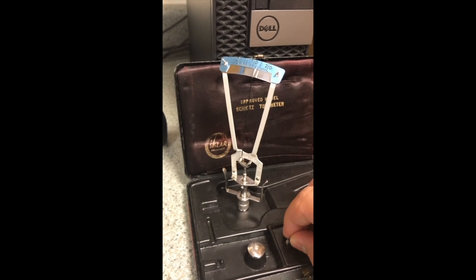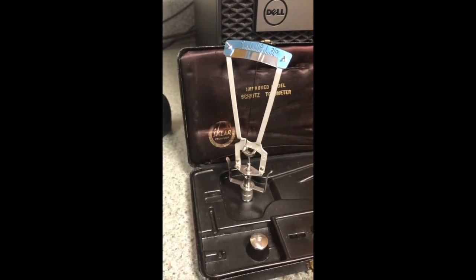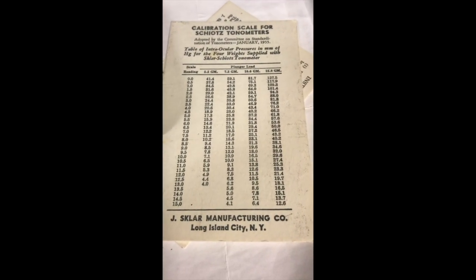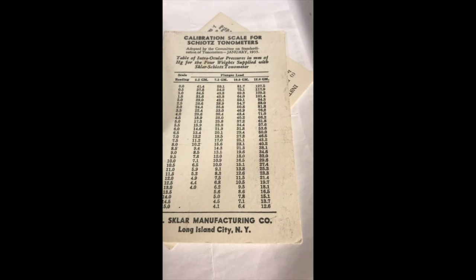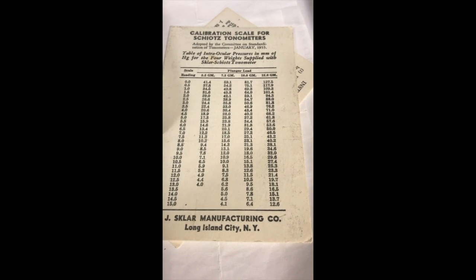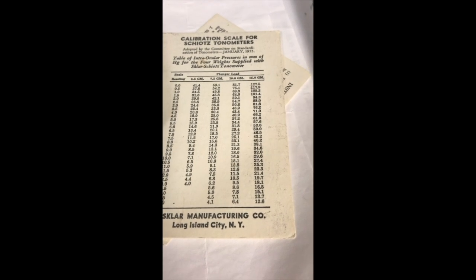The first thing you need to do to get it set up before you take it to the patient is to pick the weight that you want to use. On this conversion chart, you can see that heavier weights will give you higher intraocular pressure measurements. It depends on what you anticipate the pressure to be, and if you get a number that's below zero or it's pinging at zero, then you should go to the next weight up so that you can get an accurate reading.